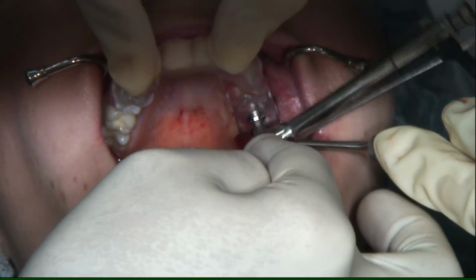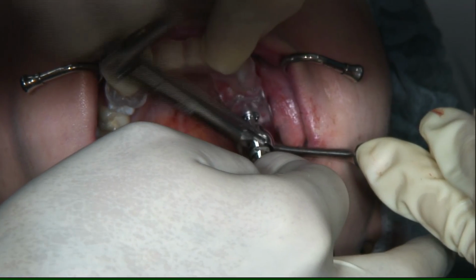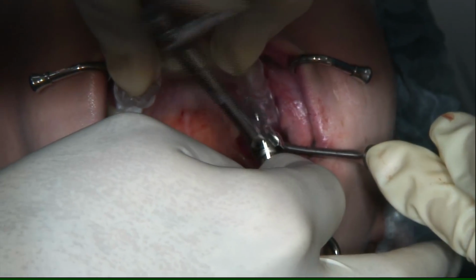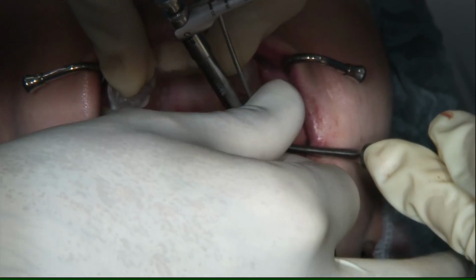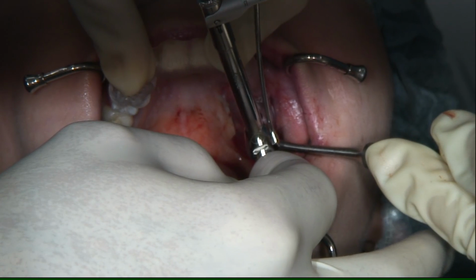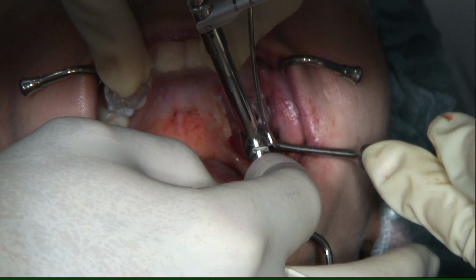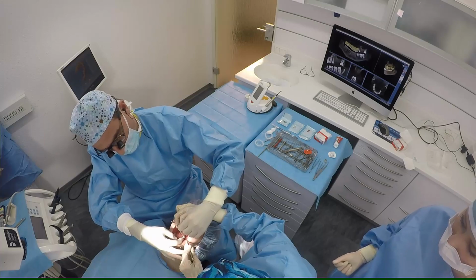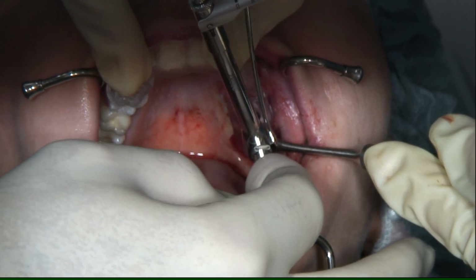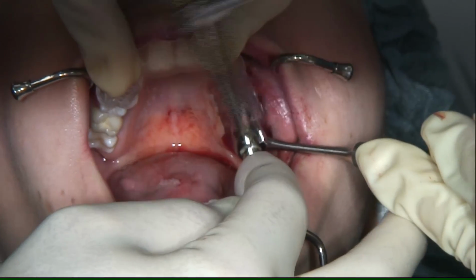We can do a one-time abutment concept, that means that we place an abutment after this. We have prepared the abutment already before, or we prefer submerged healing, so that we close. It all depends on the primary stability.